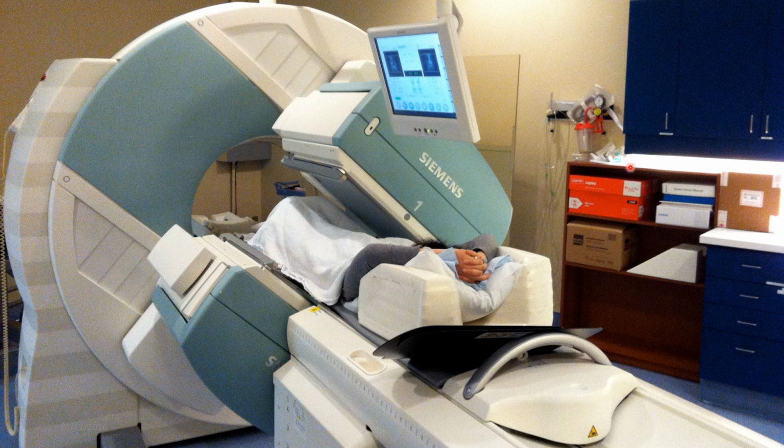But this is your average nuclear medicine gamma camera. It's a Siemens gamma camera, and what it's doing is, once we give the patient an injection, in order to look at the gamma rays, we have to give an injection of that technetium bound to something. So we'll combine that technetium with a product that binds itself to lungs, for example, or kidneys, as I mentioned earlier. And then we give that a chance to circulate around the body and be taken up or not taken up in organs. And so we use gamma cameras to take a picture of it.